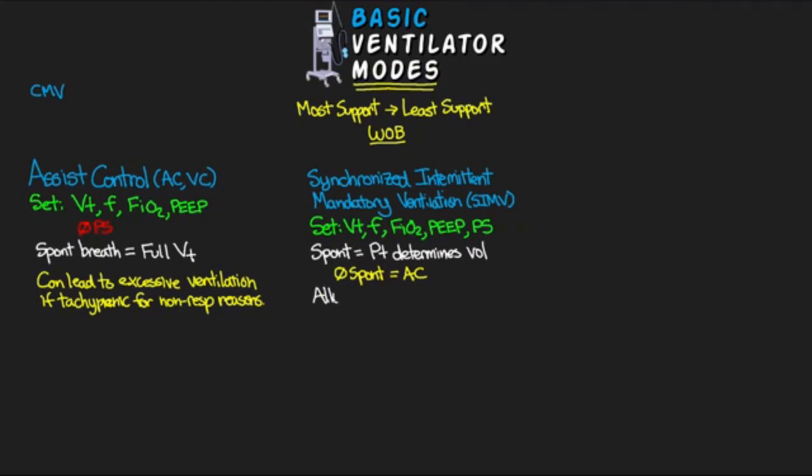Now, SIMV is really good because it can actually allow patients to gradually take back over their work of breathing over time. And so the less support that we give them with the mandatory breaths, the more work of breathing that the patient is going to need to take on their own. And so, like I said, SIMV was initially developed with the help of really weaning patients from the vent, but often we find it as one of our primary modes of ventilation.